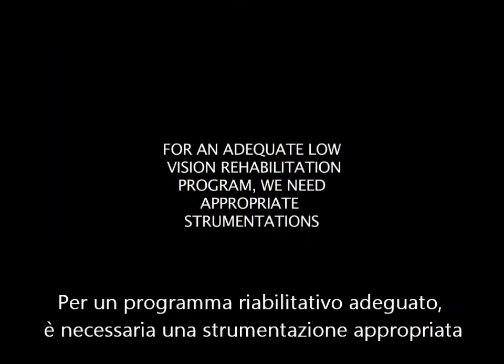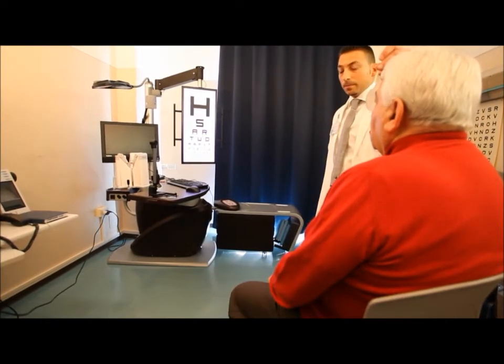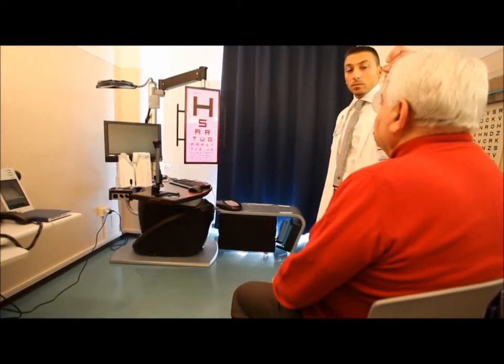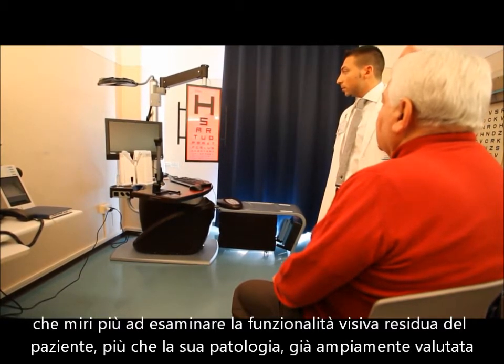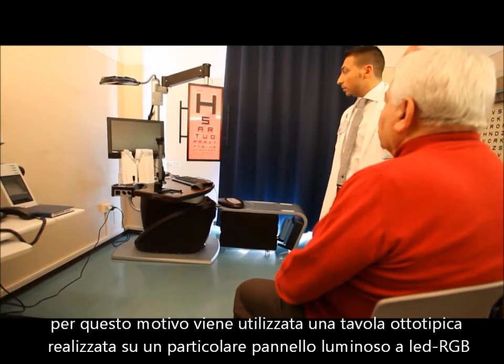At our Low Vision and Visual Rehabilitation Center in Milan, we have assembled in a very small space all the equipment we need for assessment, rehabilitation, training, and prescription of visual aids which best meet the patient's needs. The patient is asked to report how many letters he can read on the illuminated board at a distance of 2.5 meters.